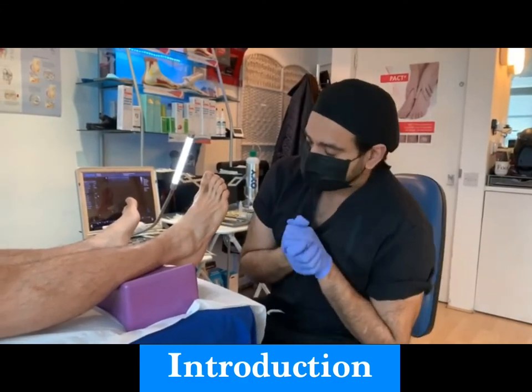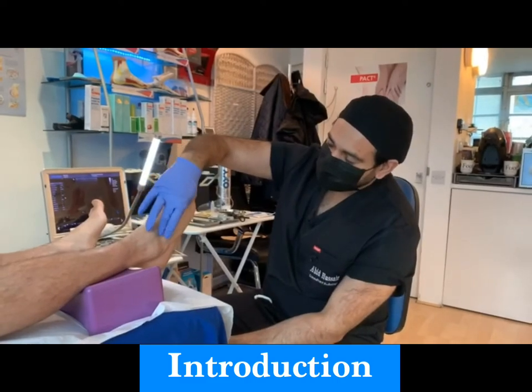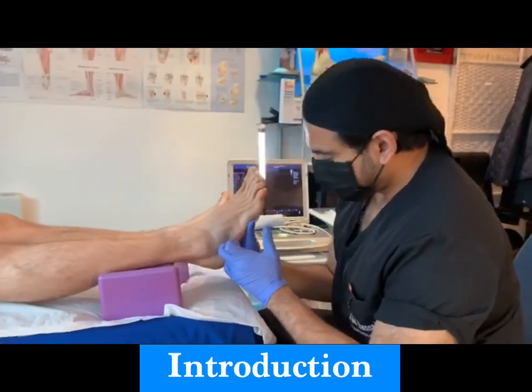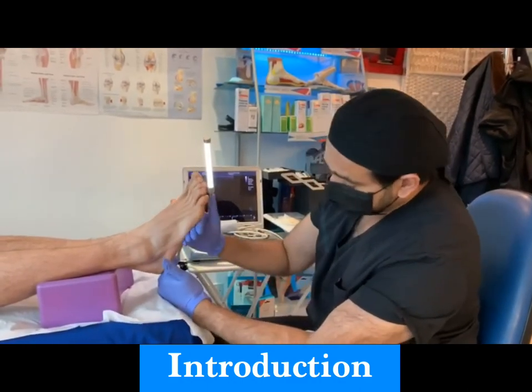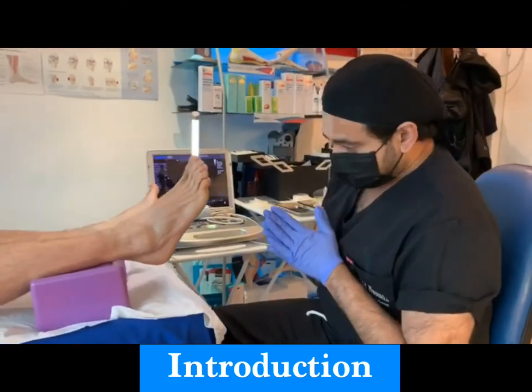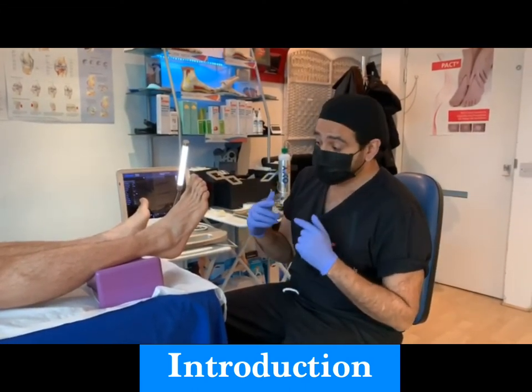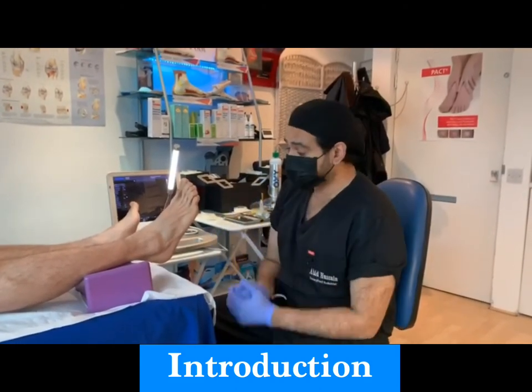I'm going to give him some local anaesthetic to knock out the superficial peroneal nerve and the sural nerve just in case, and then we're going to give him an ultrasound-guided corticosteroid injection, having taken all the precautions. He's also had an orthotic with a four-degree wedge on the outside of the rear foot and the cuboid to offload him. And as with all my injection patients, he's got a progressive rehab program, because the injection on its own isn't going to do it. It's all three things — the orthotics, the rehab, and the injection — that give him a really good chance to get back. When he returns to running, he'll go back progressively.